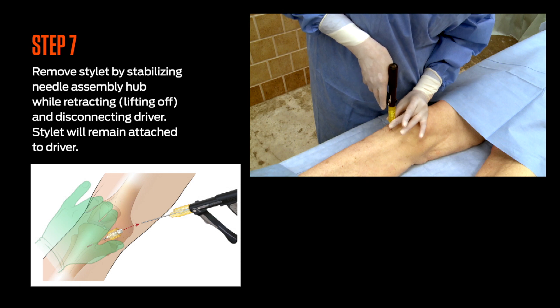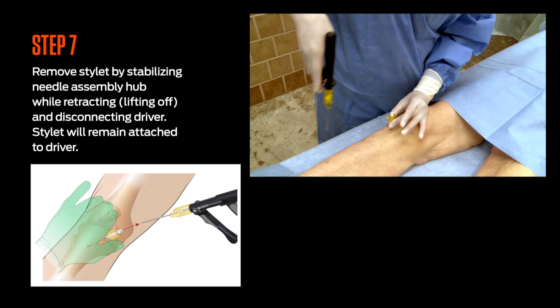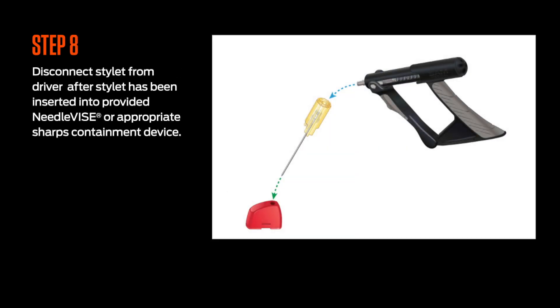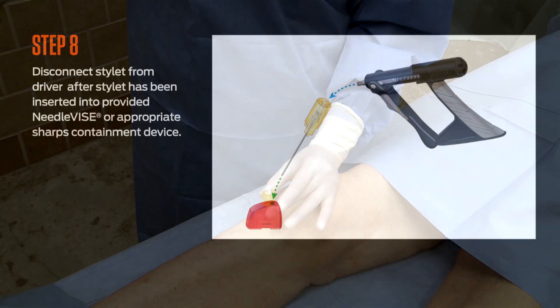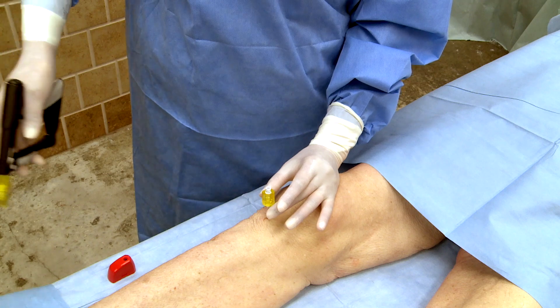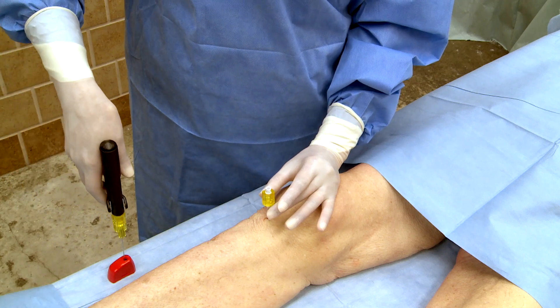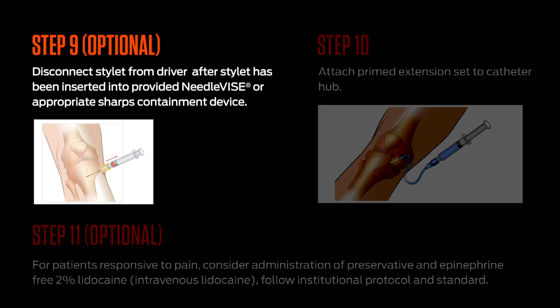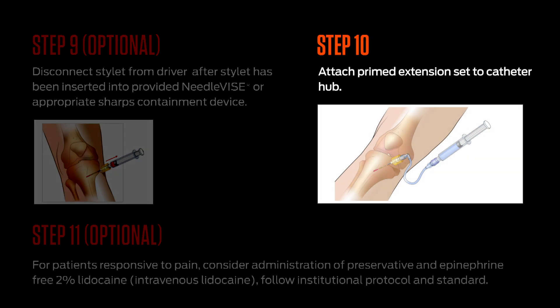Step 7: Remove the stylet by firmly stabilizing the needle assembly hub while simultaneously retracting, lifting off, and disconnecting the driver. Step 8: Disconnect the stylet from the driver. Place the provided needle vise on a flat, stable surface and firmly insert the stylet directly down into the open needle vise. Step 9 (optional): Obtain blood samples for laboratory analysis. Step 10: Attach the primed extension set to the catheter hub and firmly secure by twisting clockwise.